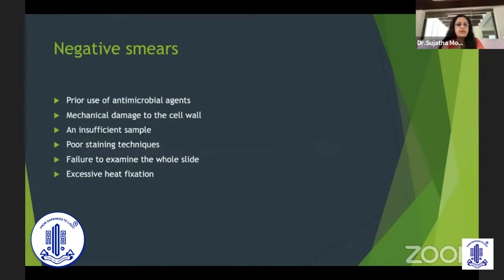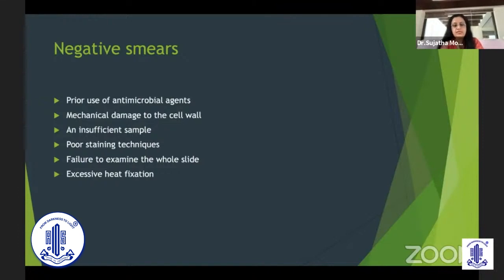Negative smears can be seen in patients already treated elsewhere or with antimicrobial agents, when there is mechanical damage to the cell wall, when there is insufficient sample acquired — such as with very small or deep-seated ulcers where you see only epithelial cells — or due to overstaining techniques and excess heat fixation. Also, failure to examine the whole slide may mean missing positive areas.